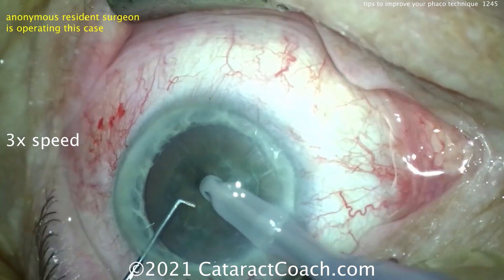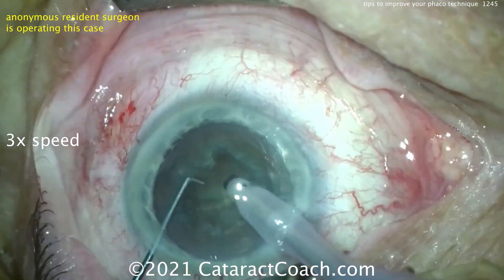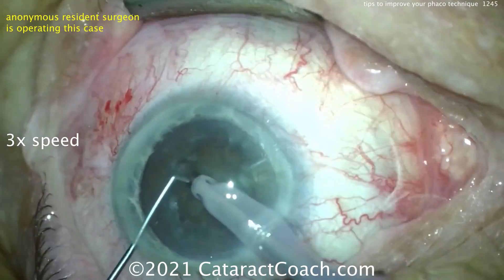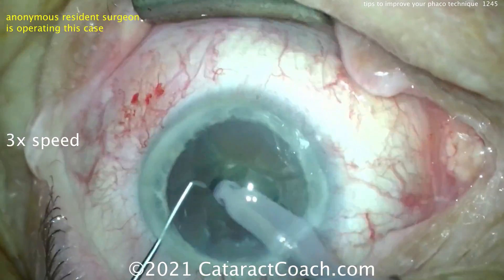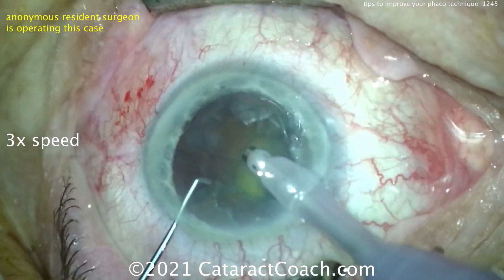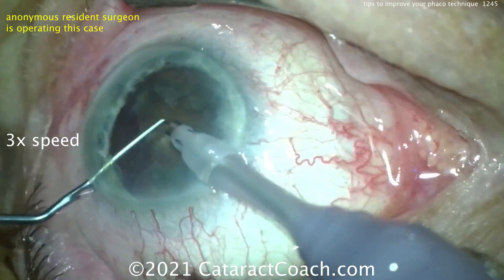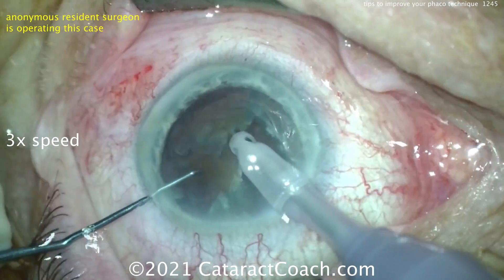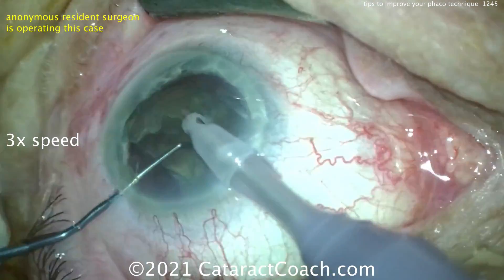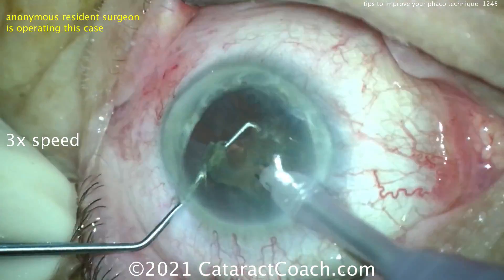You've got good hands, there's no question — you're going to become a great surgeon one day, but let's start fixing some of these little problems now. This looks like a divide and conquer technique. Not ideal — in this case I'd have the patient lift the chin up, and that'll give your eye a lot better positioning. Right now it seems like you're chasing the eye around a little bit. You can see it's not staying centered to those three lights — the Purkinje images are not in the center of the cornea. You've got to float the incision and keep the eye in primary; see those Purkinje images are now over the incision.